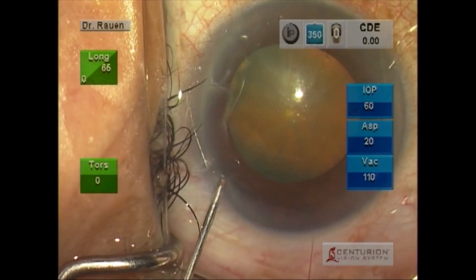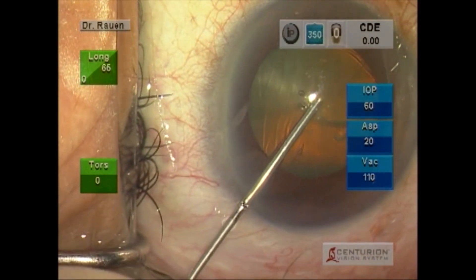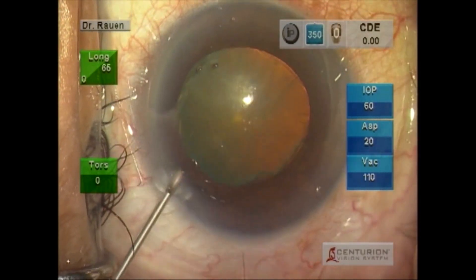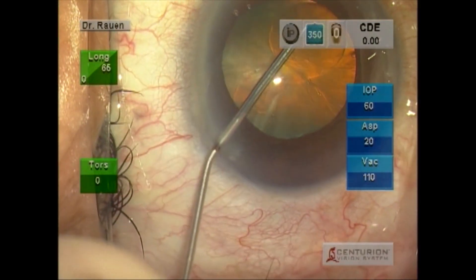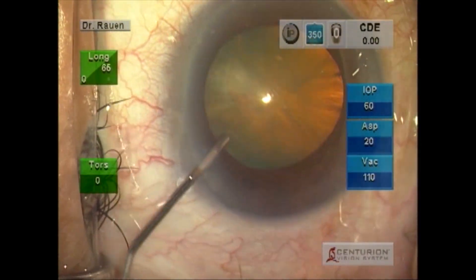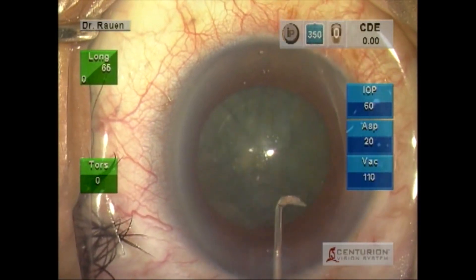We begin by delivering intracameral anesthetic, followed by placement of Viscoat up near the corneal endothelium, and then Provisc directed at the iris plane in an effort to obtain a little bit more dilation.